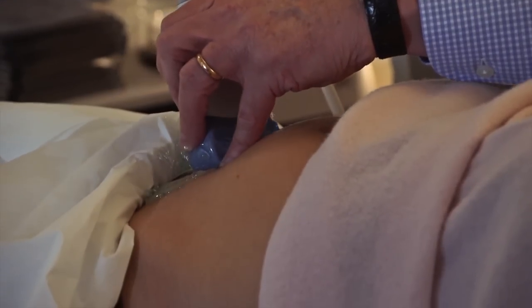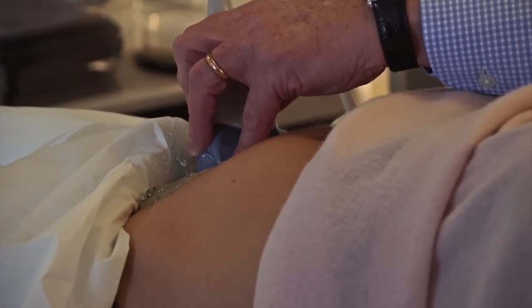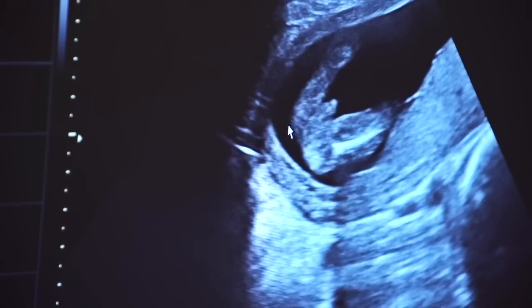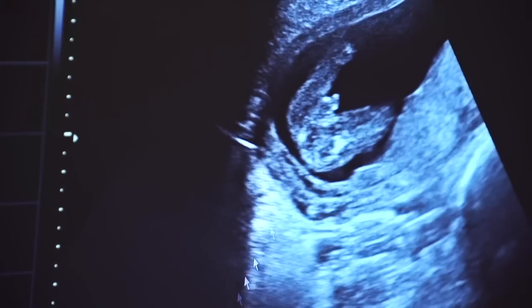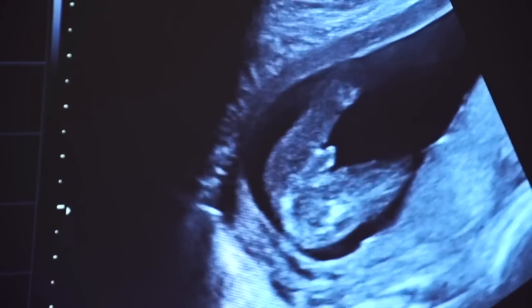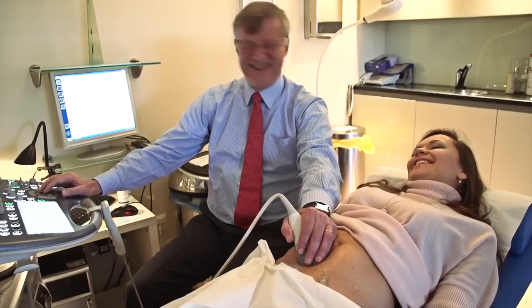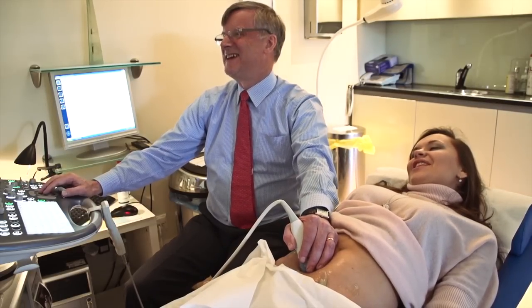The scan is always performed through the tummy, and the measuring part of the scan will take a minute or two. It will then depend on the cooperation of the baby. If the baby opens its legs and shows us what we need to see, it can be done in a minute or two. But more often it takes a little bit longer while we encourage and cajole the baby to get into a position where we can see the sex clearly.